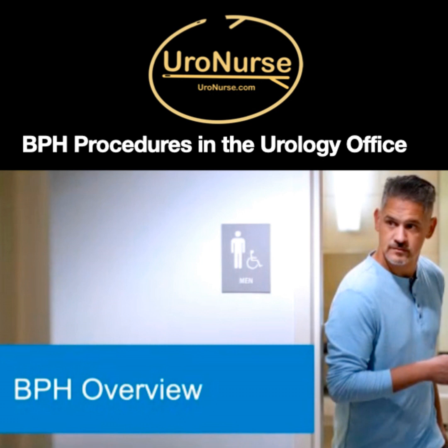And I presented a couple different things, so that's probably part of the confusion. In the SUNA Urologic Nursing Core Curriculum, first edition, it says, and I quote, to be beneficial, the lubricant, 2% lidocaine gel, should be indwelling in the urethra at least 15 minutes. And she gives the page for the curriculum. I was glad to hear about the almost immediate use of Glydo gel pre-procedure, but this complicates things a little. Can you please clarify regarding your research from today and the textbook information? Thank you for this resource, Vic. I really appreciate your Saturday mornings.